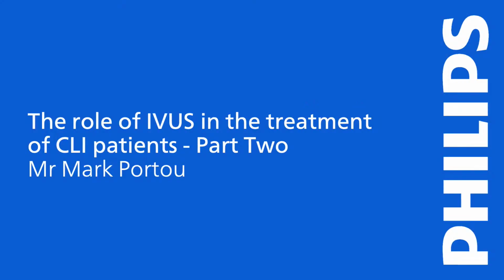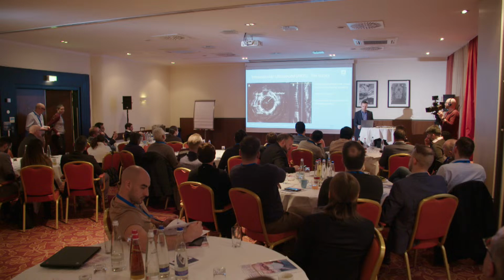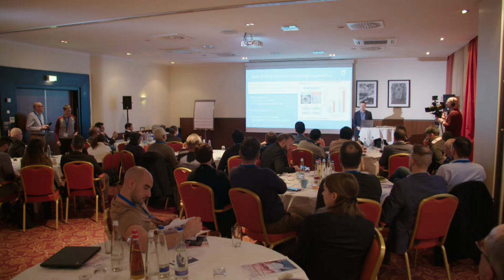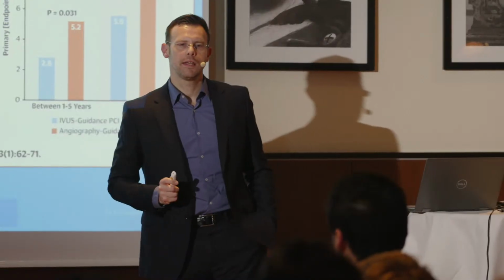A lot of this, I think, NT would have covered far more eloquently than me, but we'll start really, you know now what you're looking at, from NT's talk. I don't need to go through this again. Catheter-based, miniaturized ultrasound machine using a piezoelectric transducer. What can we learn from cardiology?